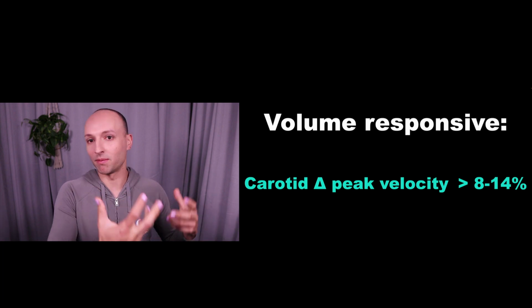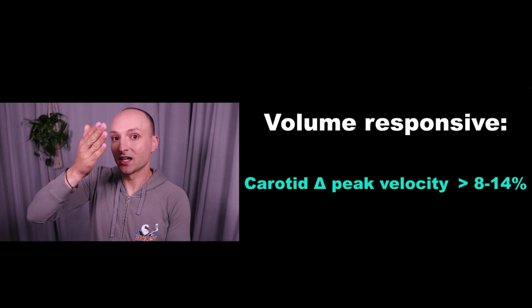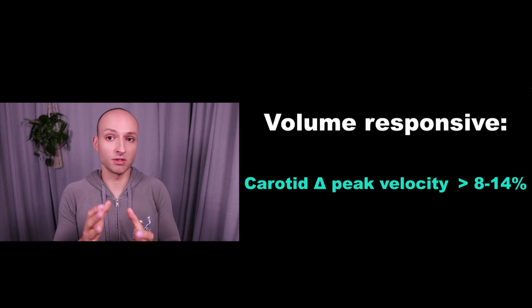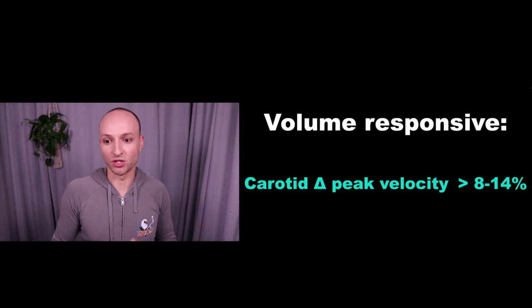And that's one of the problems, by the way, with volume responsiveness: there's really no cutoff number that always means the patient's volume responsive. So it's always a range, and you determine it based on the clinical situation.